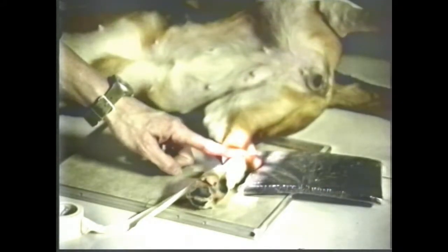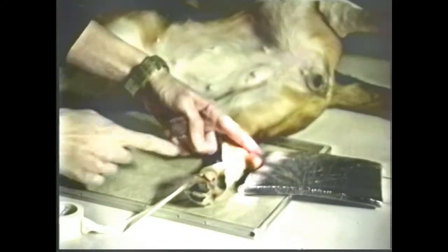A sponge is placed under the calcaneus to rotate the leg so that it is true lateral of the tarsus. The part is measured. The foot is taped down to the table so that the tarsal area is horizontal on the X-ray cassette.